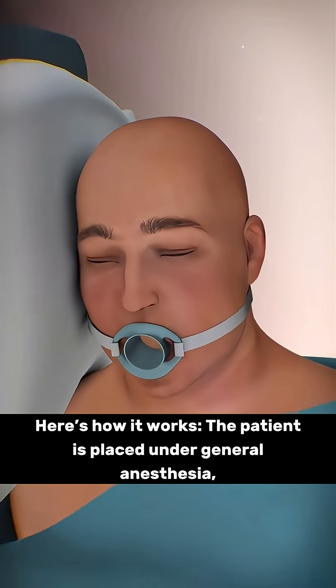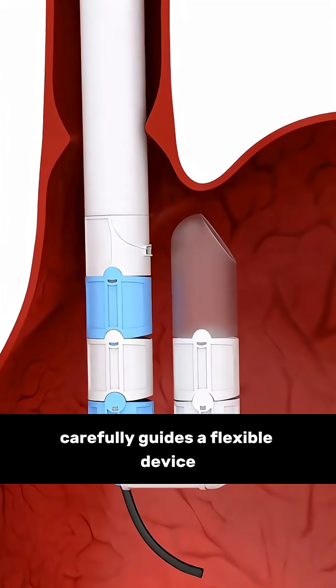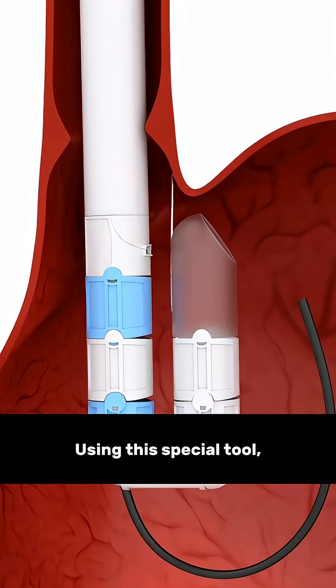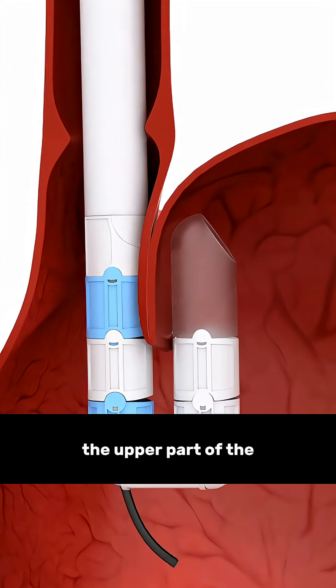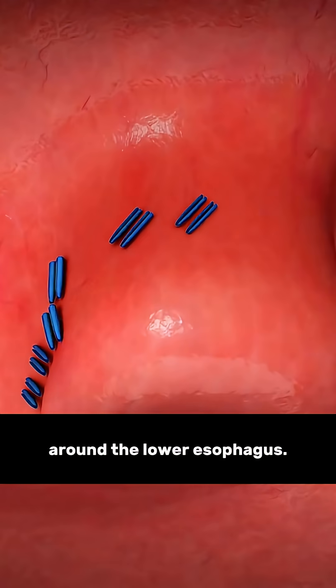Here's how it works. The patient is placed under general anesthesia and the doctor carefully guides a flexible device through the mouth and into the esophagus. Using this special tool, the upper part of the stomach is gently folded and attached around the lower esophagus.